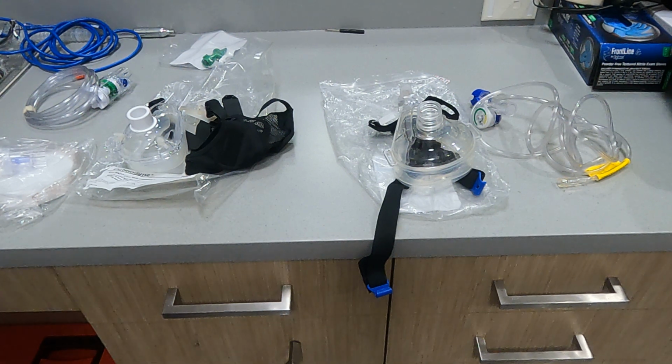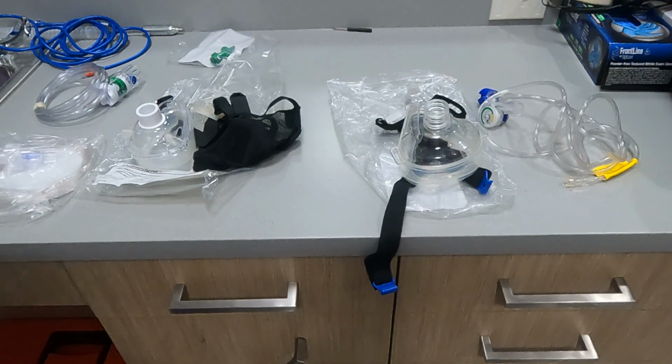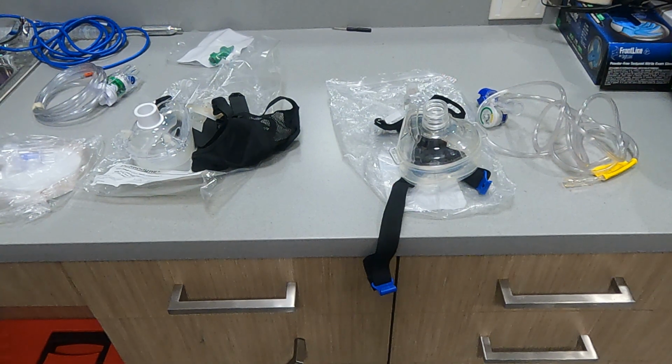You also cannot use this on any patient who you suspect has a pneumothorax, because that pressure is just going to cause that pneumothorax to progress rapidly. You cannot use this on any patient who is vomiting, because once again, we're just going to force that vomit right down into their lungs. Your patient must have a systolic blood pressure greater than 90. Because of this pressure that we're putting in there, it can reduce preload to the heart. When you reduce preload, you reduce blood pressure. If we reduce their blood pressure too much, obviously they're probably going to go unresponsive, and we don't want that.